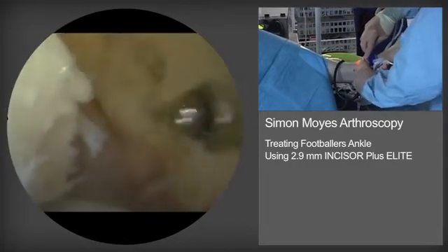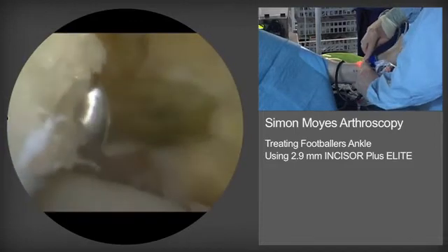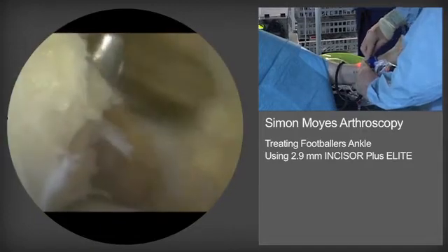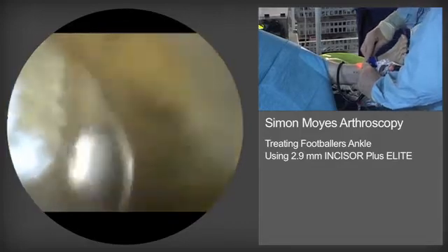When operating on large tibial spurs, I find it useful to irrigate posterolaterally using the Wolf cannula. This improves fluid through-flow and clearance of debris.